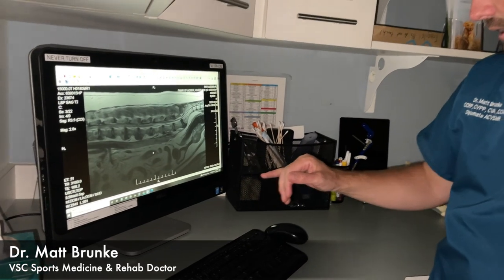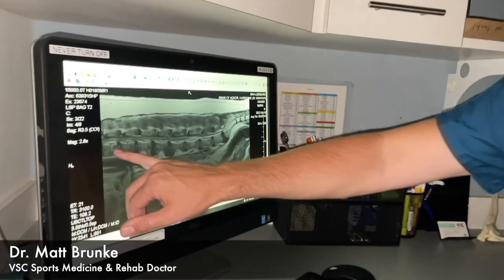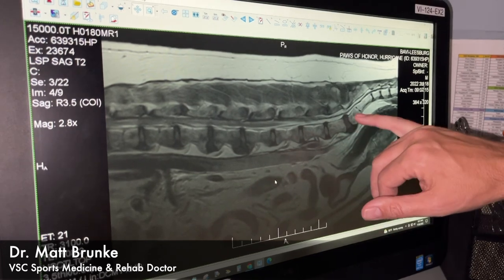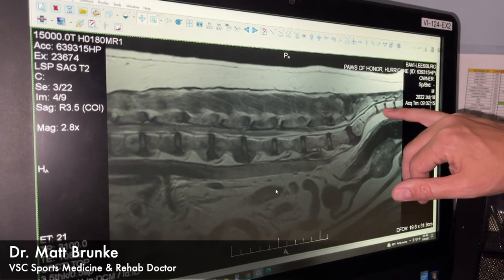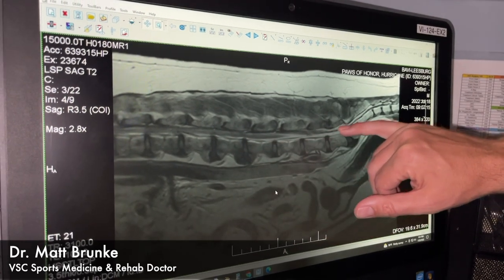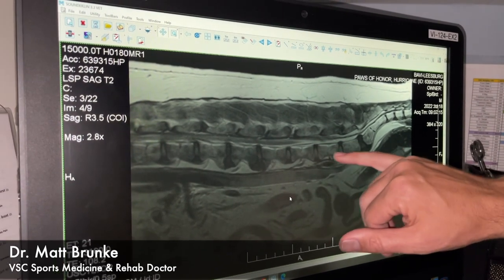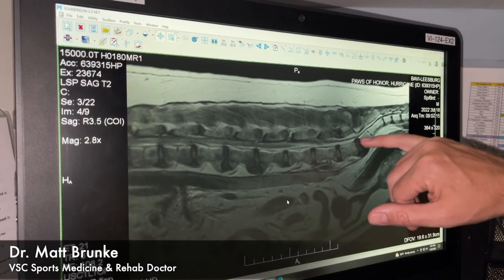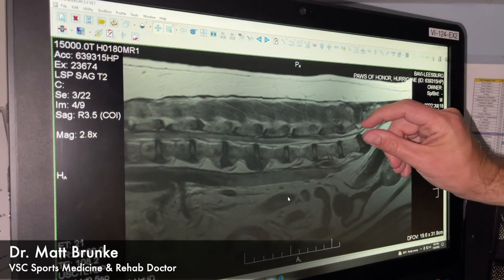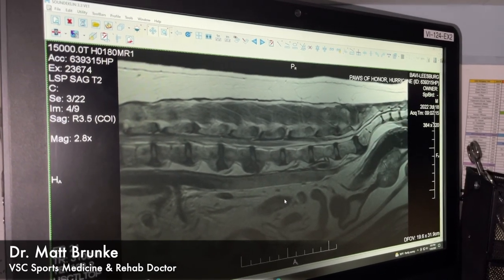We've got Hurricane's MRI here. Looking at his low back, we can see all the vertebrae, and here's the beginning of his tail — this is right where the spinal cord sits. You can see how the discs here don't bulge up, but this disc right here between his lumbar and his sacrum is pushing up and it's pinching on his spinal cord, causing him some discomfort in his back legs.